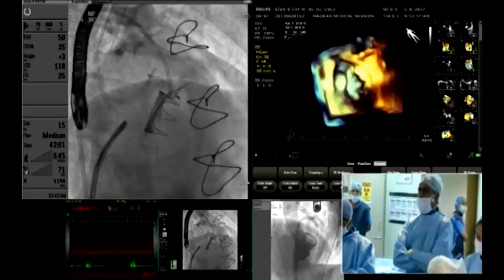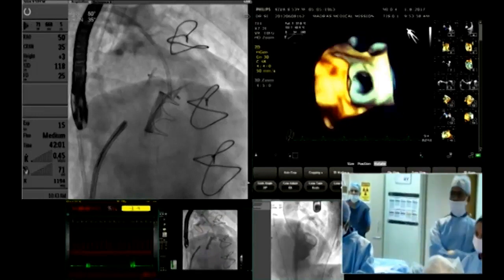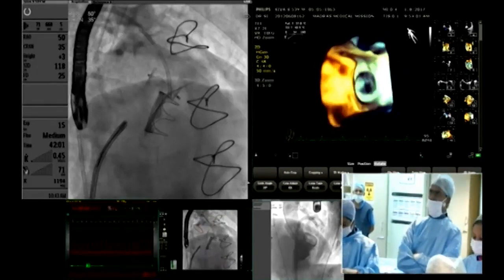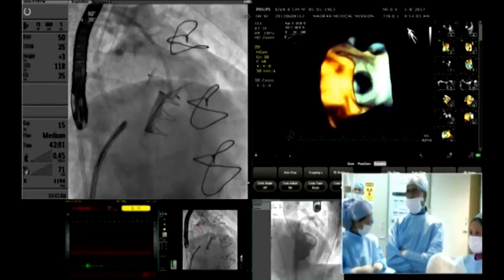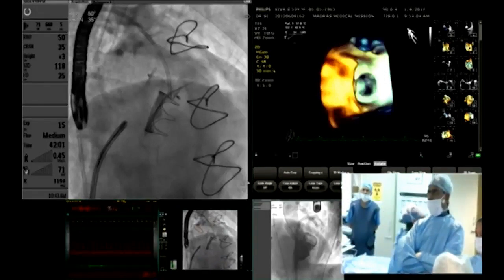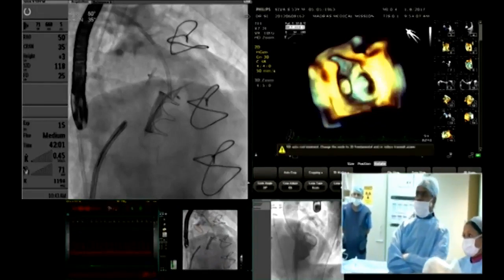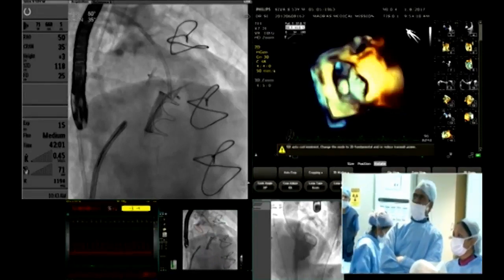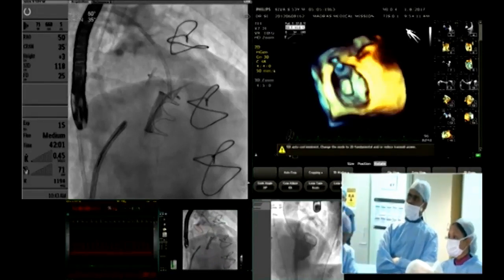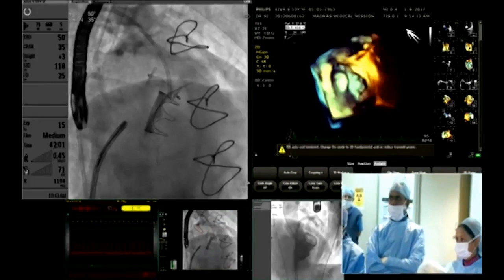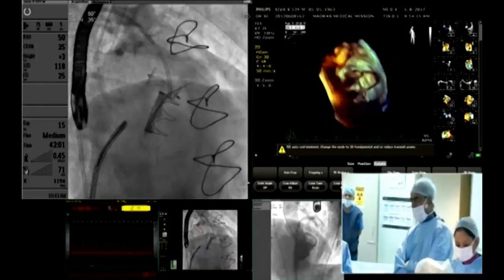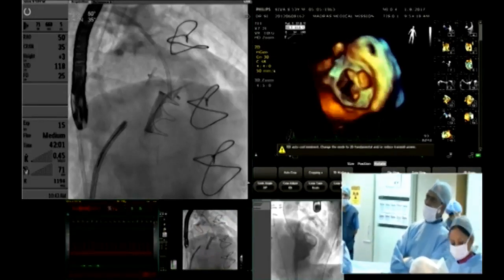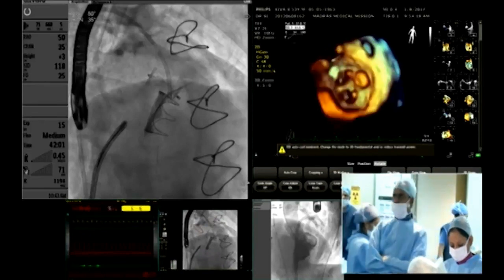Dr. Sreeja is having beautiful pictures. The mitral valve prosthesis is seen nicely. She is showing the device now — showing the left atrial appendage as a black round dot on the top and now from the ventricular side. That is the ventricular side. You can see the tri-leaflet bioprosthesis and you can see the device sitting there. It looks nice — this is perfect.